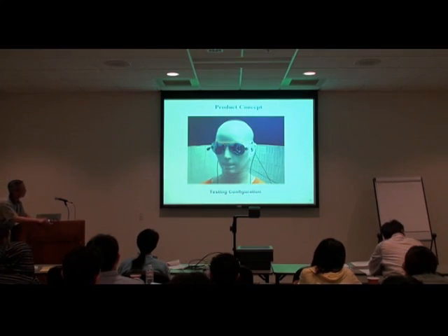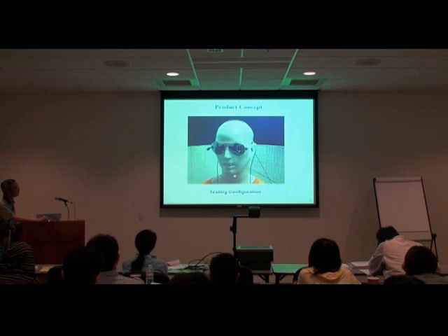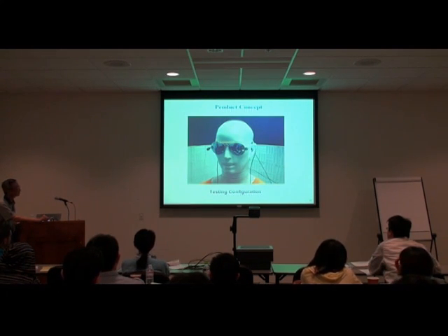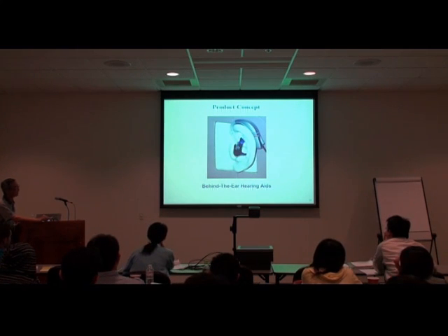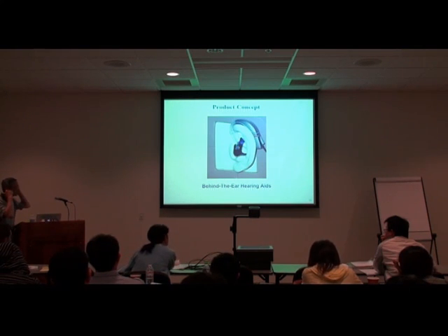So then we need to start considering the product concept. Initially, we thought we could put the microphones here in front, at the corner of the eyeglasses. But certainly this is not practical, because nobody's going to wear a microphone here in the corner of the eyeglasses. So more practically, it would be putting the microphone in the ear itself, up here. This is behind the ear here. And for that, you have to do some transformation of the signal so that this signal is representing sound from the side.